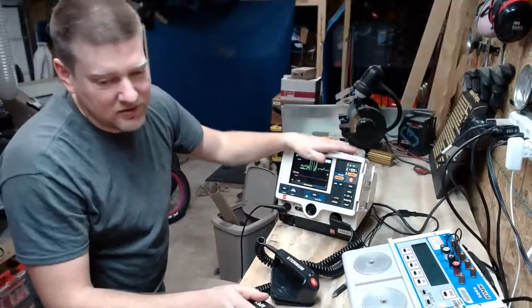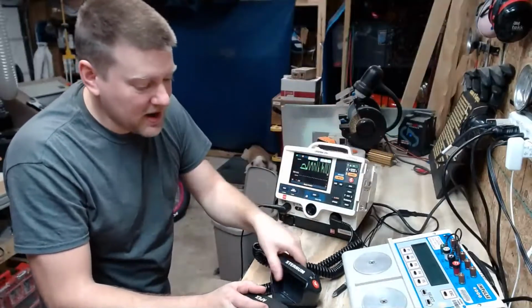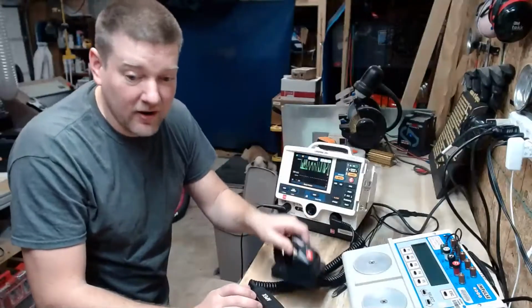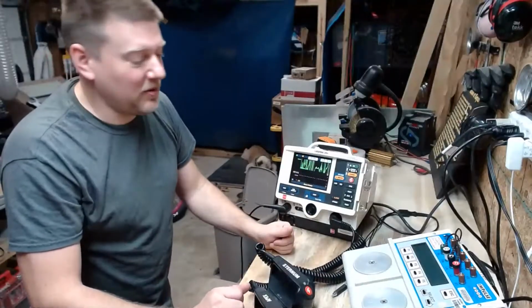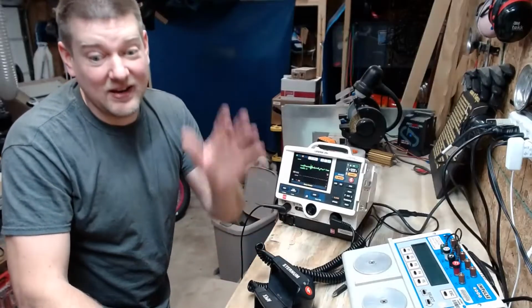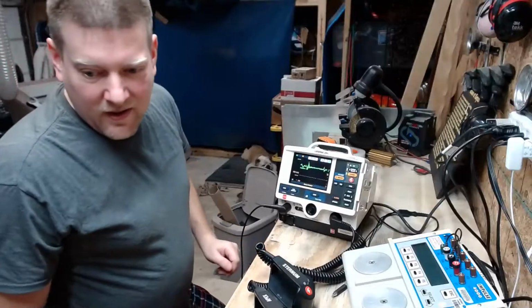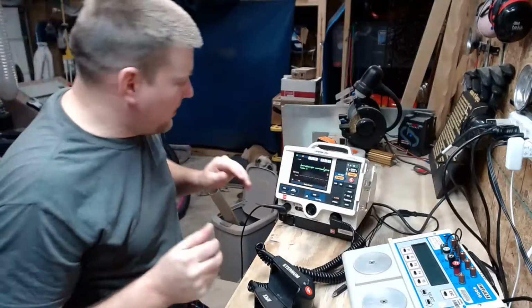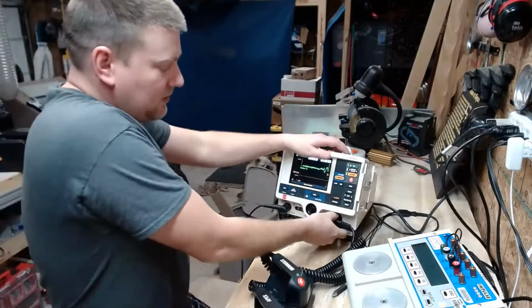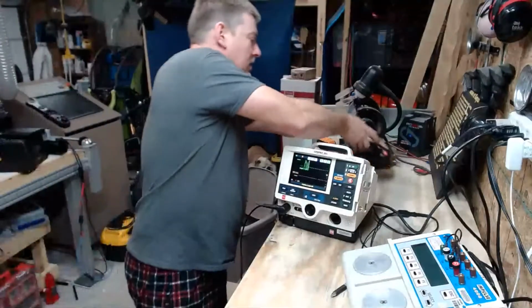Whenever you're dealing with life support equipment, make sure you document everything. And if it's got bad paddles, if they're chipped, cracked, whatever, replace them. Replace them, or suggest to your customer that they get them replaced. Document that you suggested it needs to be replaced, okay? So let's see. That is testing with paddles. I think you guys get it, the paddles.